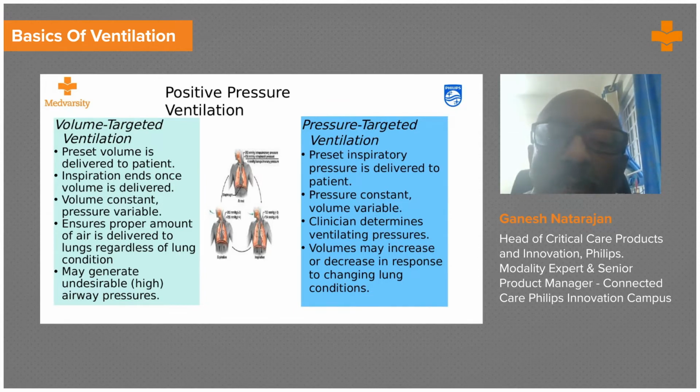And the volumes may increase or decrease in response to the changing lung condition, meaning a more compliant lung will be able to get in more volume than a less compliant lung.